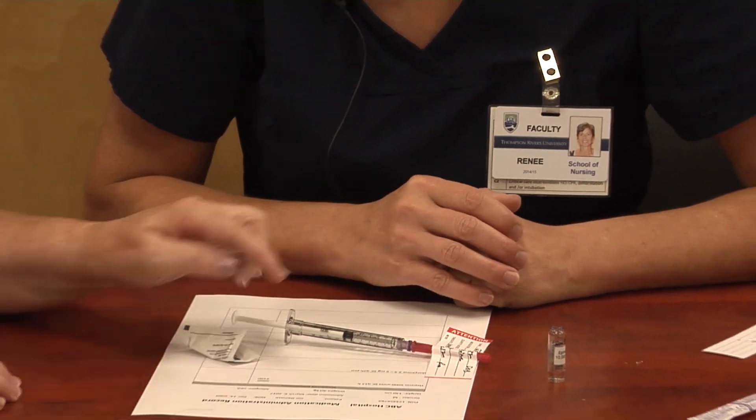When doing narcotics, if it's 0.5 mL but that represents five milligrams of morphine, you write the dose in milligrams on the label. However, until you're very familiar with your drugs and know that five milligrams equals 0.5 mL, you might also put the volume down — because if you get to the bedside and the syringe has been slightly depressed, the volume can serve as your double-check.